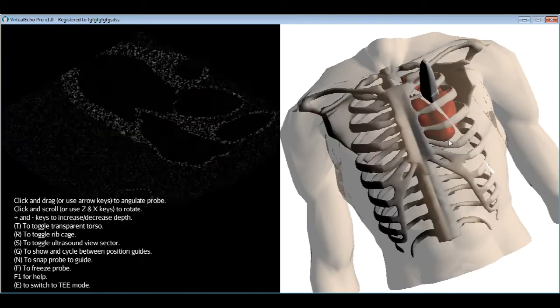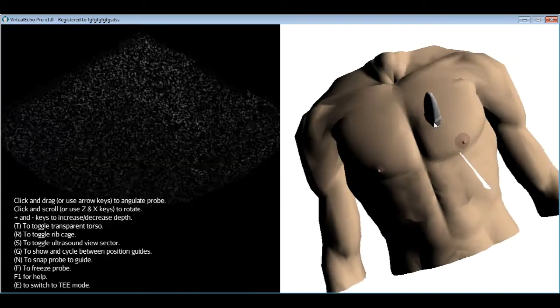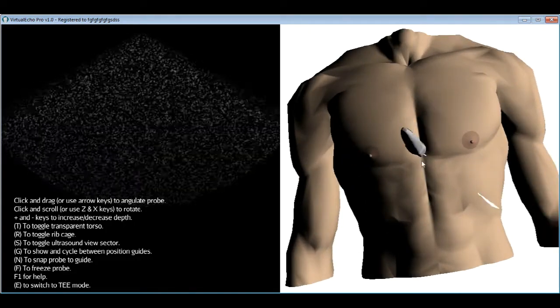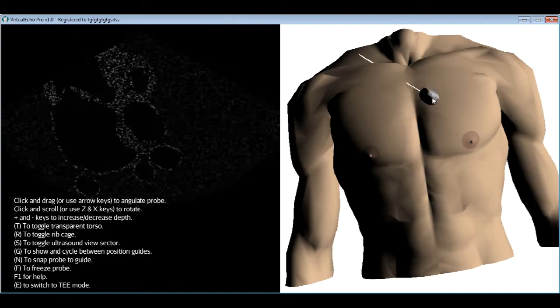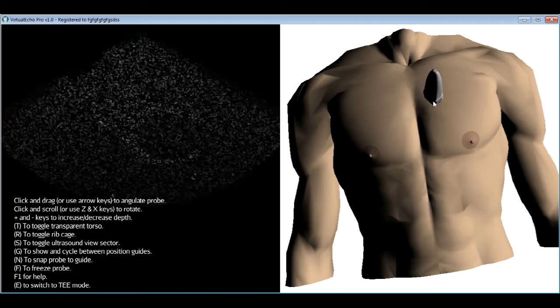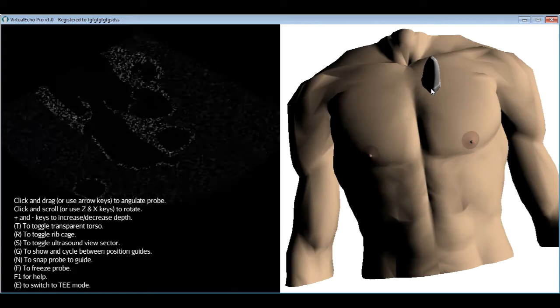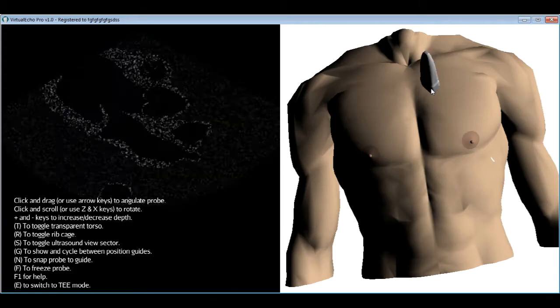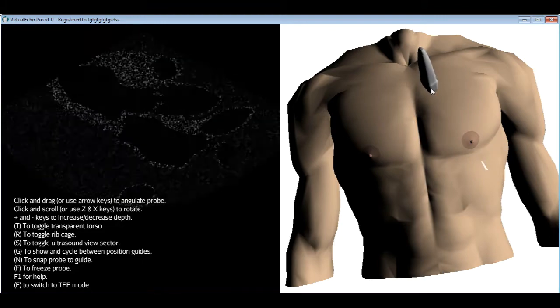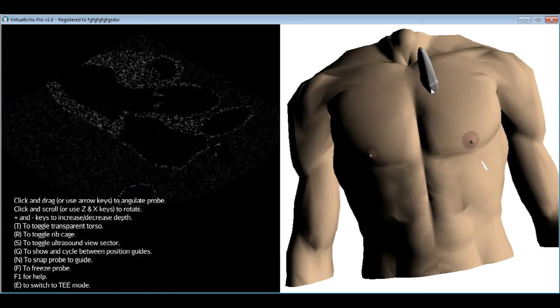To practice getting this view from scratch: place the probe at the second or third left intercostal space, rotate so the knob points away from the apex, fix the tilt slightly, and adjust rotation so the ventricle appears long. That's a good left long parasternal view.